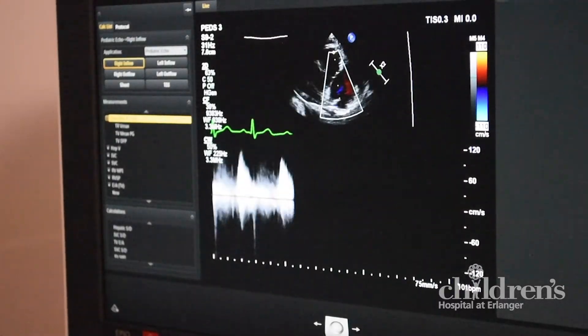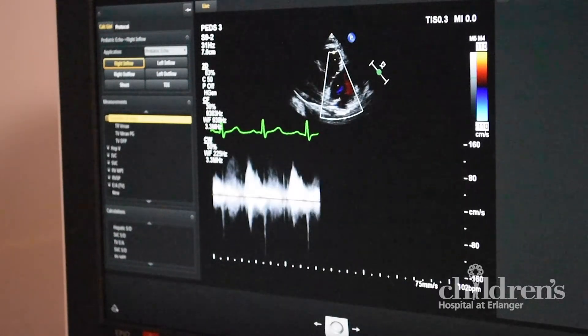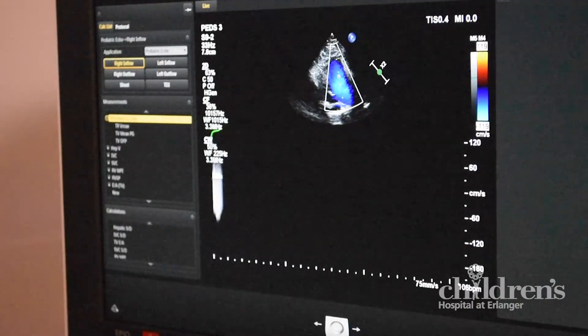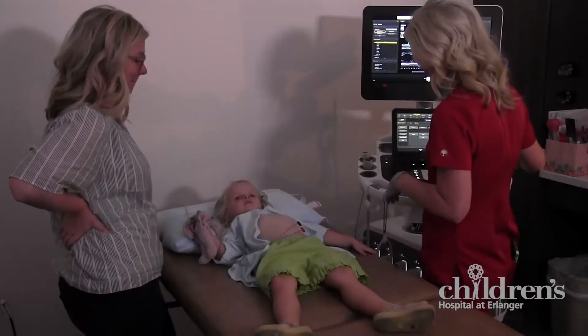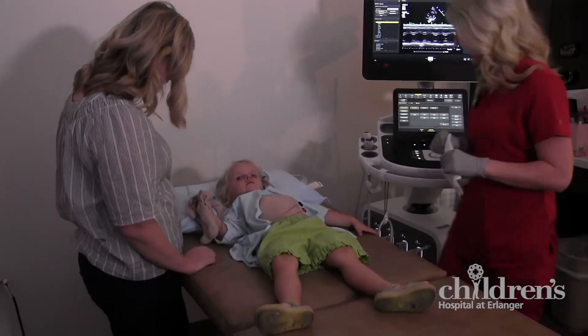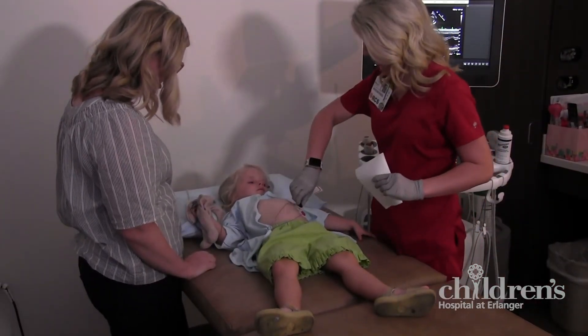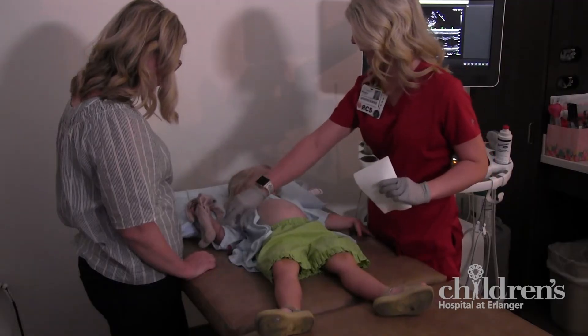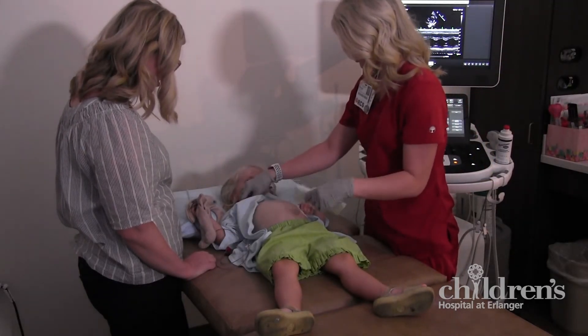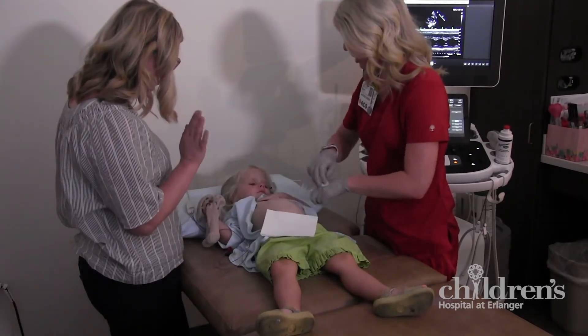You will also hear loud sounds from the ultrasound machine. These are the sounds of the blood flowing from one chamber of your heart to another, and the valves opening or closing as the blood moves through your heart. Our computer records all of these pictures and sounds for your heart doctor to review and evaluate.